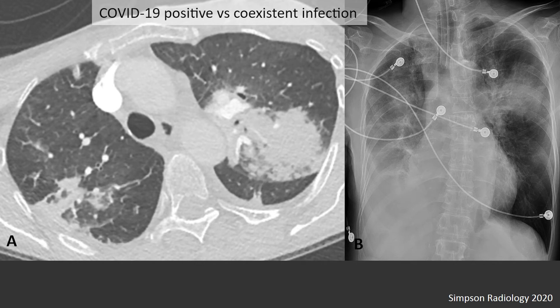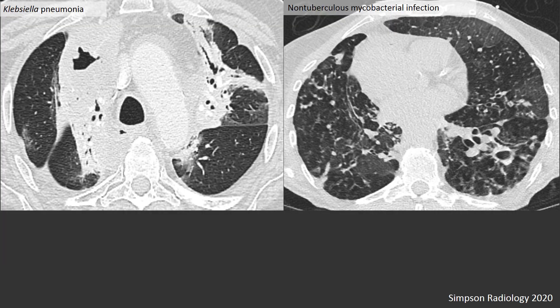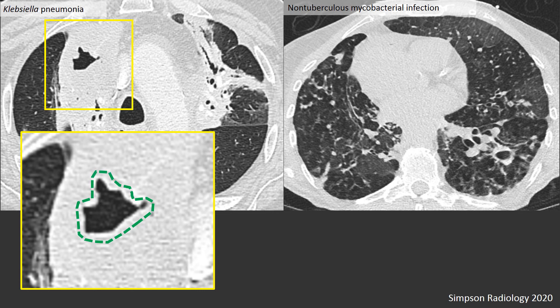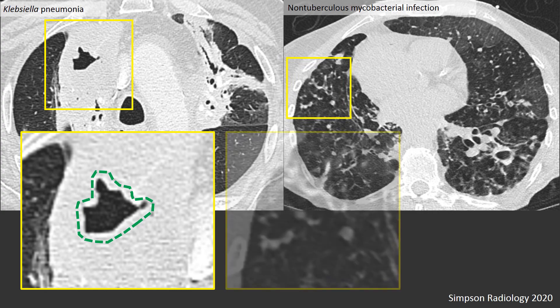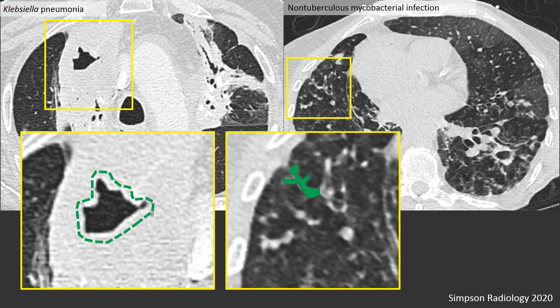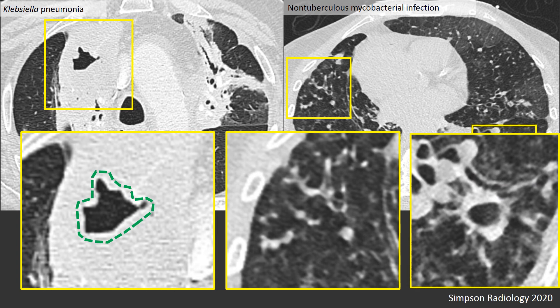Here's a case with atypical features: segmental consolidation in the left upper lobe visible on both CT and chest radiograph. This person did test positive, but there was debate as to whether this reflected COVID-19 or a secondary infectious process such as bacterial pneumonia. A Klebsiella pneumonia case demonstrates consolidation without ground glass opacity and an area of cavitation — which has not been reported in COVID-19. Atypical mycobacteria demonstrates tree-in-bud opacities and a single focus of cavitation, also infrequently reported in COVID-19.